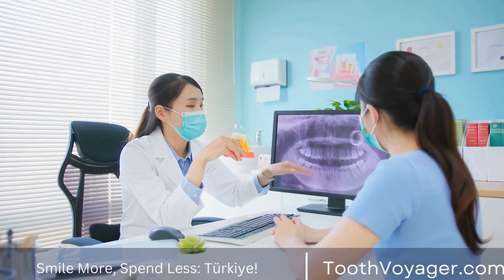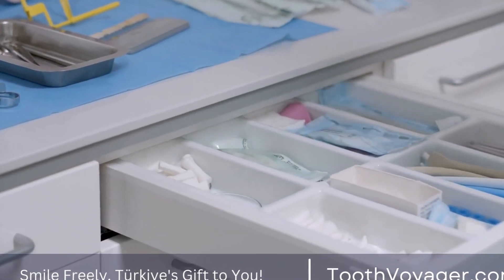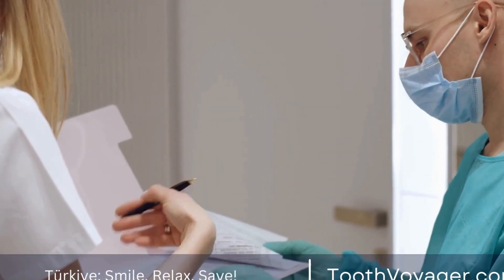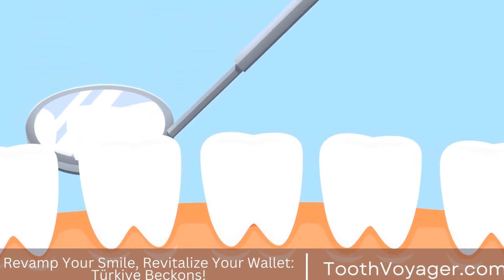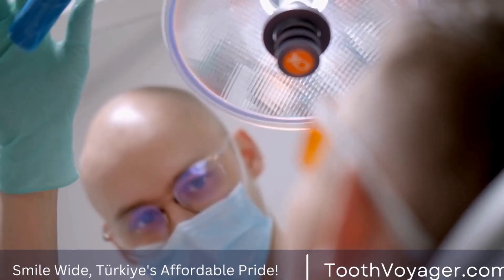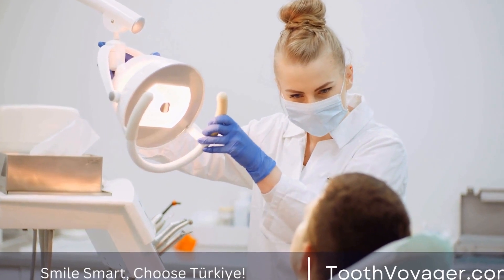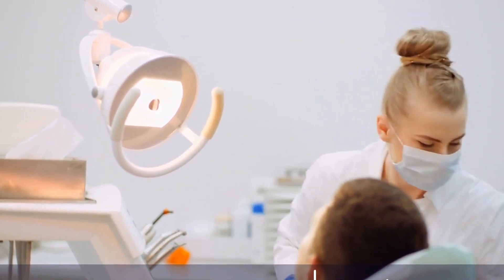Placement of the bridge. After the custom-made bridge is complete, you'll return to your dentist's office for the final fitting. Your dentist will test the fit to confirm it sits comfortably in your mouth and make any necessary modifications. The dental crowns holding the bridge are bonded to the natural teeth, and your dentist will make any adjustments needed to ensure your bite feels natural.